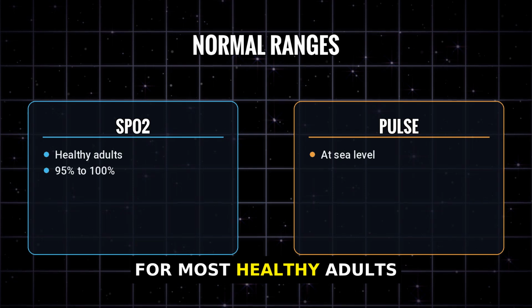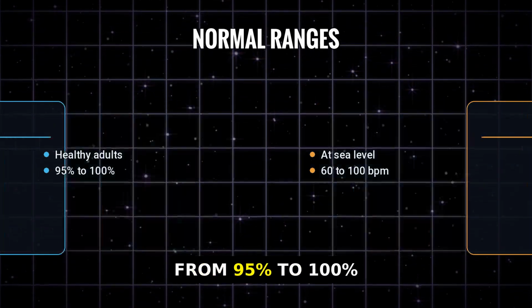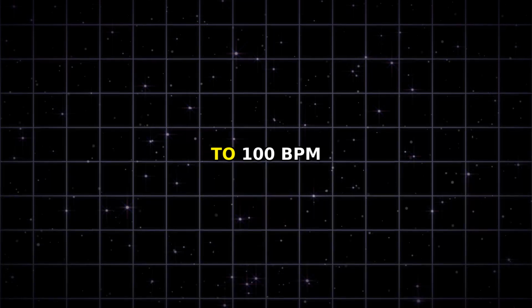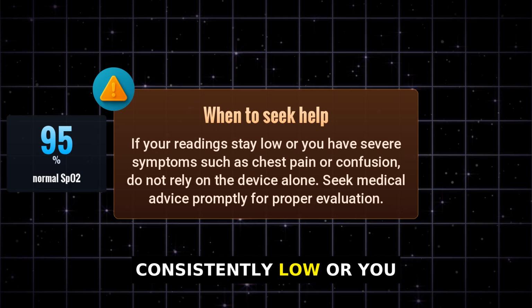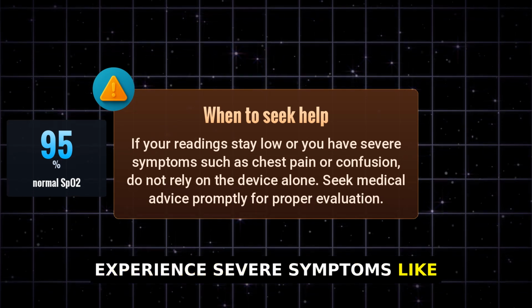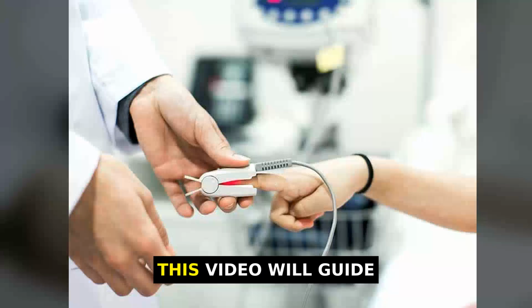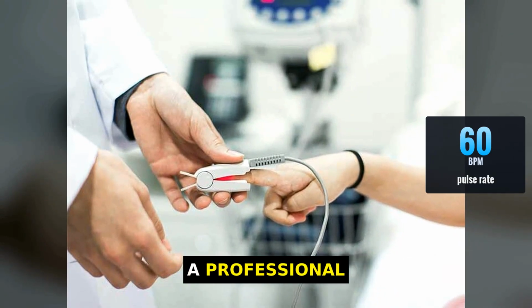For most healthy adults at sea level, a normal SpO2 ranges from 95% to 100%, while the pulse rate typically falls between 60 to 100 BPM. But remember, these devices provide estimates, not precise diagnoses. If your readings are consistently low or you experience severe symptoms like chest pain or confusion, it's vital to seek medical advice. This video will guide you through interpreting these readings and knowing when it's time to consult a professional.